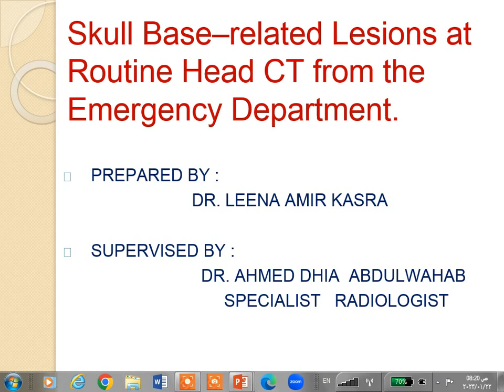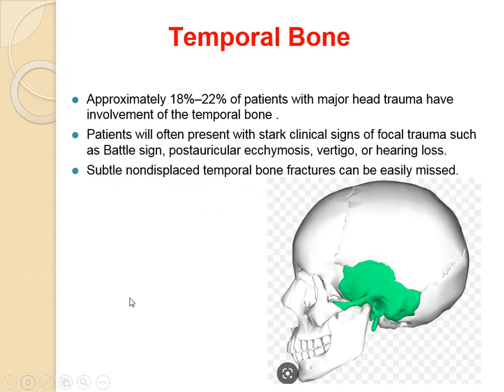Good morning, everyone. We will continue our subject from last week about temporal bone. Temporal bone is the most injured bone in facial injuries. We must suspect it in every ecchymosis, loss of hearing, any raccoon eye, any vertigo. Mostly non-displaced fractures of temporal bone can be easily missed, so we must look at the CT carefully.